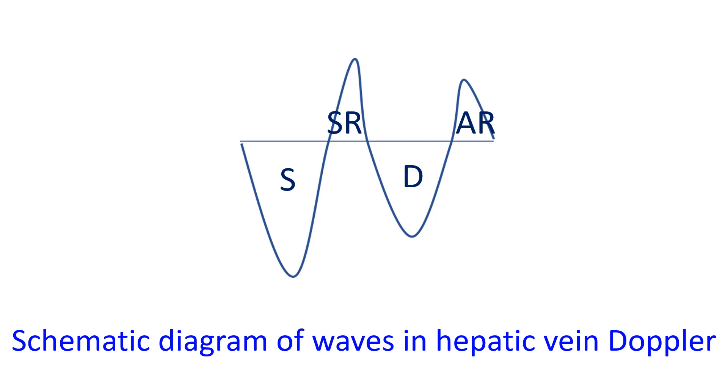D velocity occurs during right atrial emptying in diastole. A small AR wave is seen in late diastole when atrial contraction completes right ventricular filling along with small backflow into the hepatic veins.